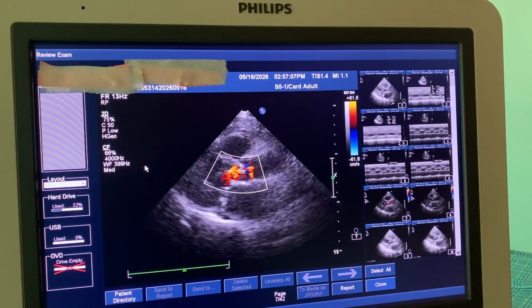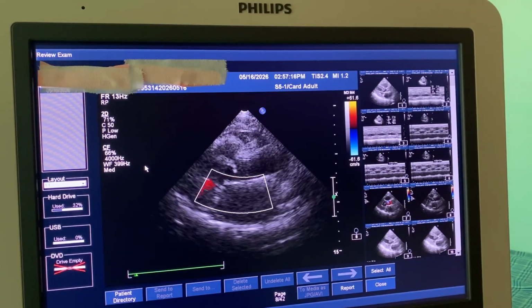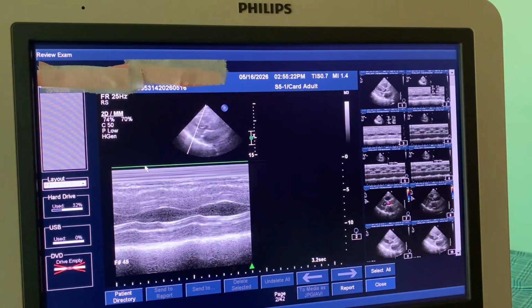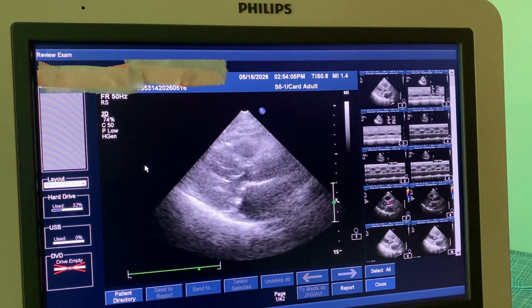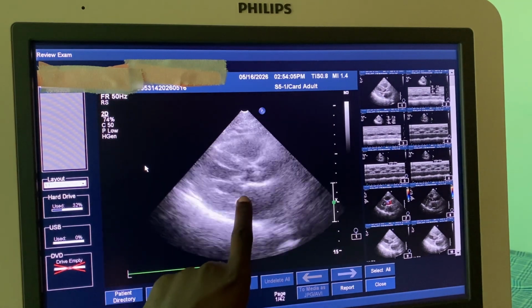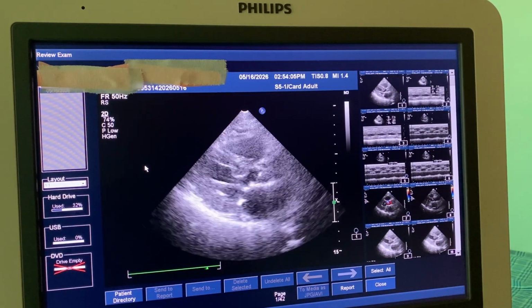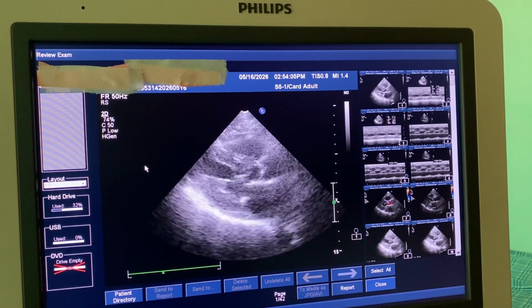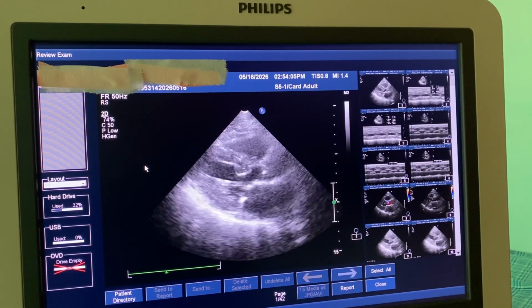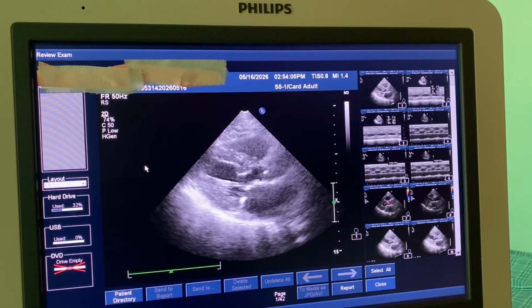And then, if we go down to the mitral, again nothing is clear. But if we go back here, you see white on the valves, and these ones are also so bright. These are calcifications. In an older person, 95, it is expected. We expect senile calcifications, but the severity will always range.